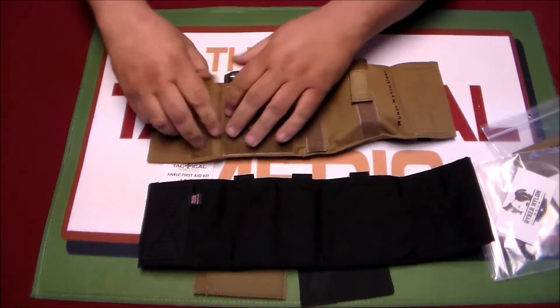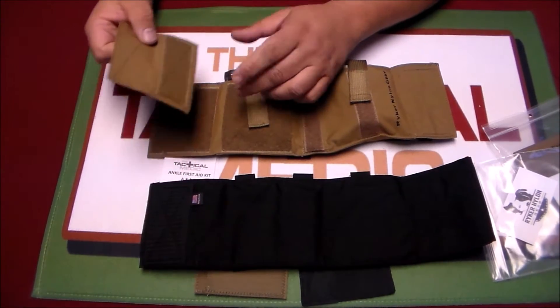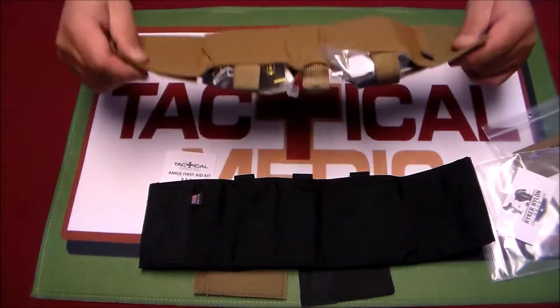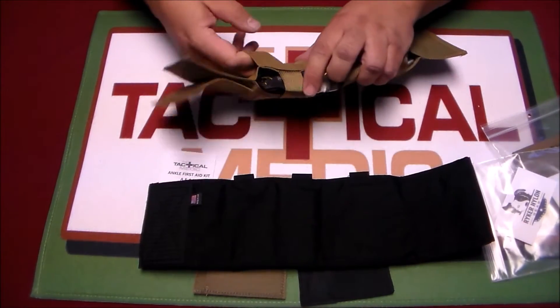It's set up with a little extender piece that you can use with or without — especially for guys wearing boots, these are kind of handy. On the back of the pouch, there's a pocket to take a chest seal.